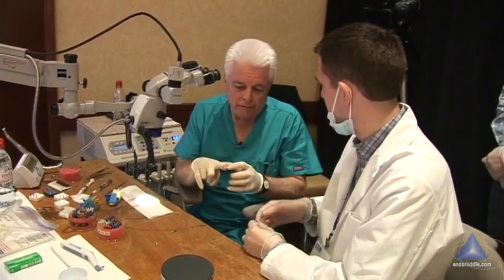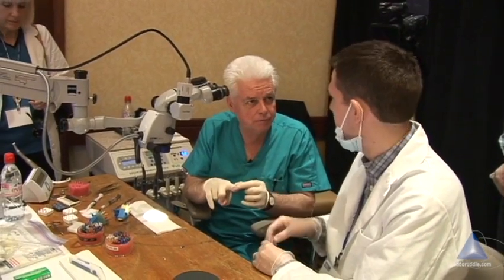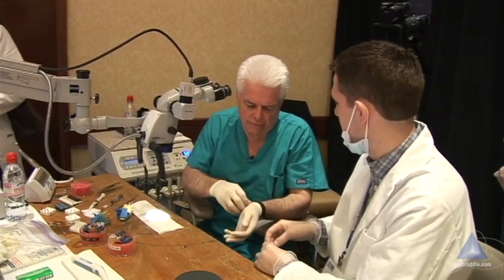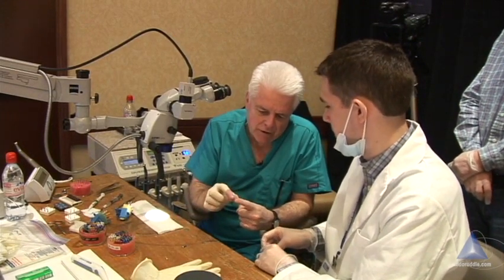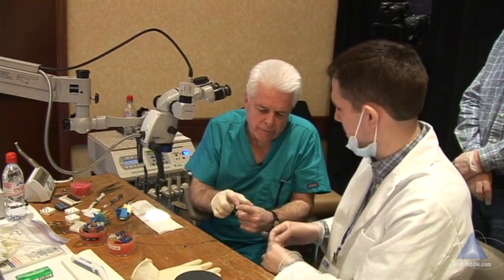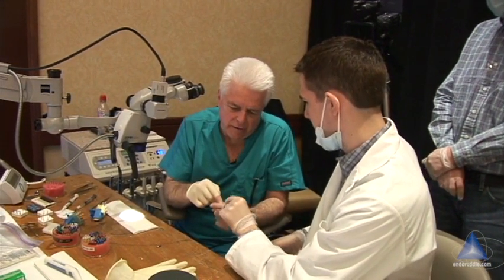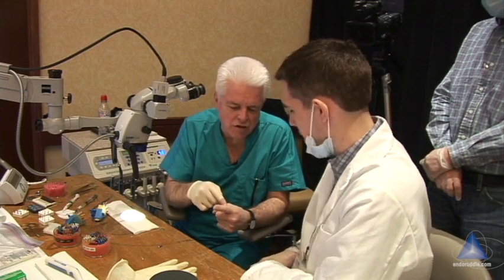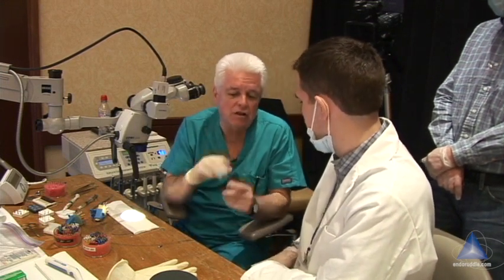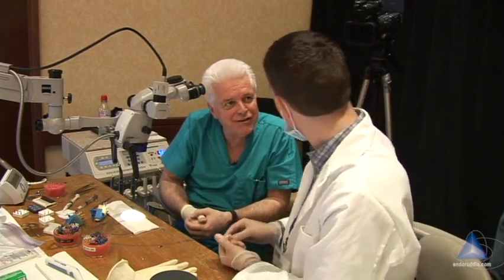That's why I went to GGs. Remember, SX has GG one, two, three, four right in the middle. A good way to learn this is just think of your finger — it's separated into thirds because you've got two joints. This is SX — never cut here with two, three, four. This doesn't really go below the orifice much, and the reason the flutes continue is so that the debris can keep being pulled up. Great — good to talk, good to work together.